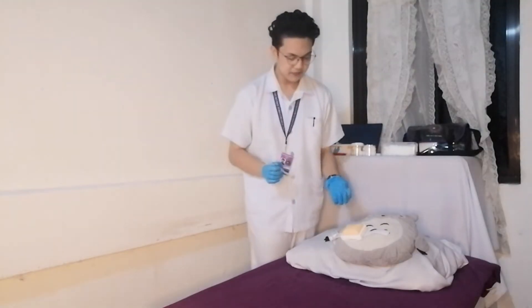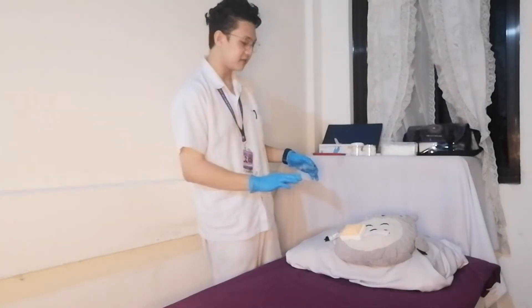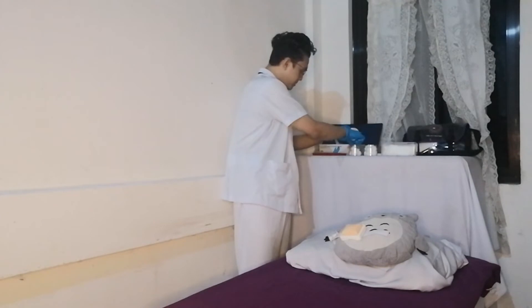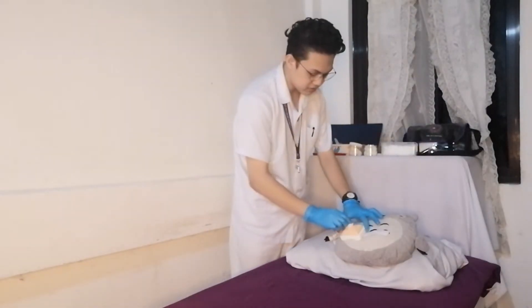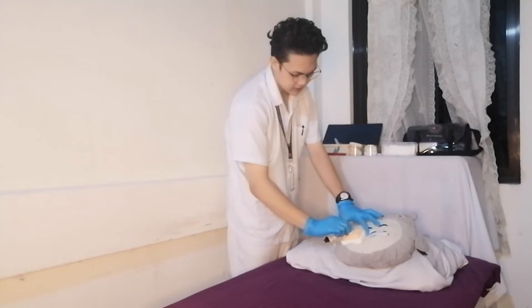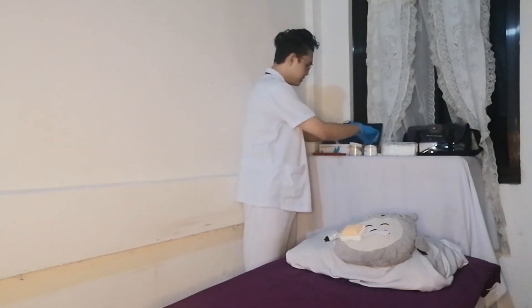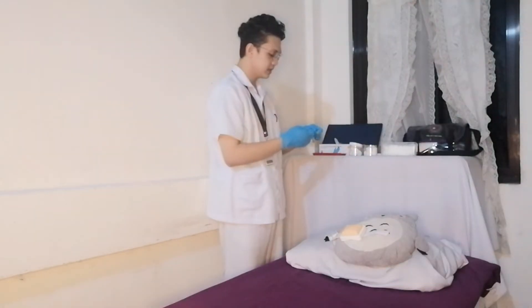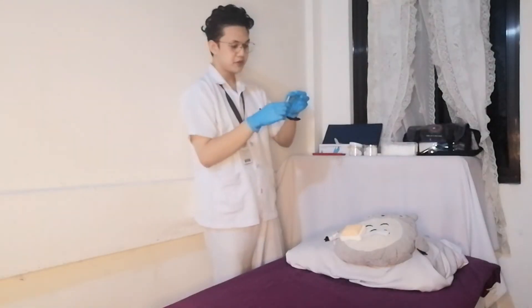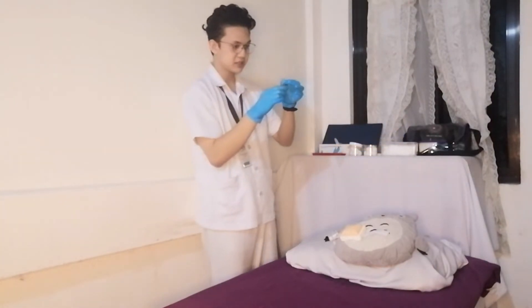I'll be checking the site and the length of the needle. I'll be pinching your abdomen — the length of the needle is right about half of the fold. I'll be using your abdomen as the injection site. I hope you're comfortable with that. I'll be cleaning your abdomen with an alcohol swab in a circular outward motion. I'll take the dry cotton ball and tape and prepare them for later. I'll be removing the needle cap and placing it in the receptacle, making sure the bevel of the needle is pointing upwards.